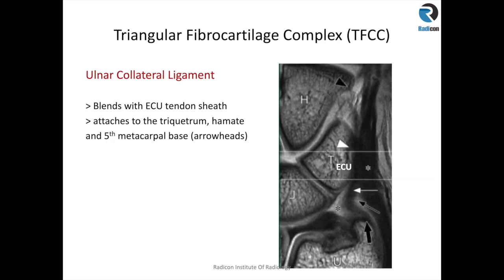The ulnar collateral ligament blends with the extensor carpi ulnaris tendon, hamate, and fifth metacarpal base, so it's a thin structure and can be difficult to separate from the extensor carpi ulnaris tendon. Some of its fibers attach onto the hook of the hamate, and onto the ulnar side of the hamate and ulnar side of the triquetrum.